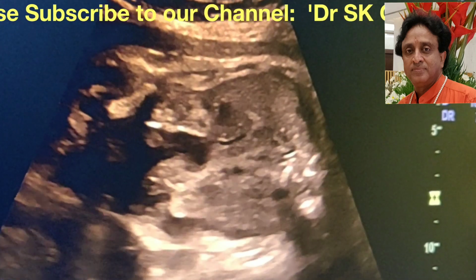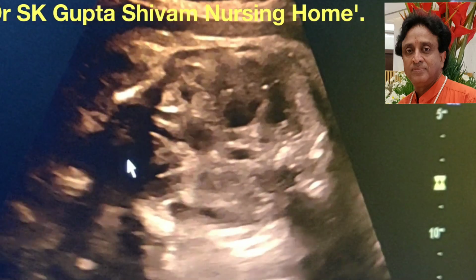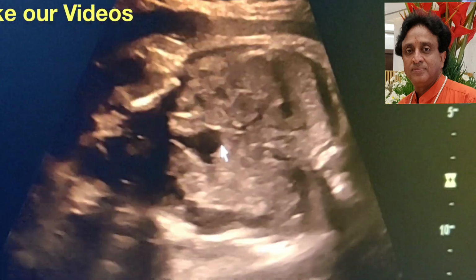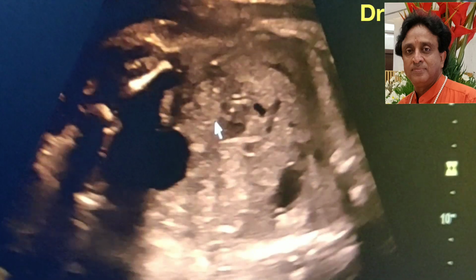I cannot demonstrate a connection here, but either it is the bowel or it is the ureter.